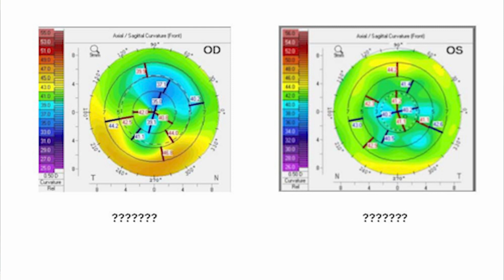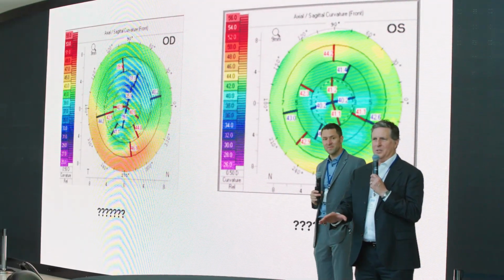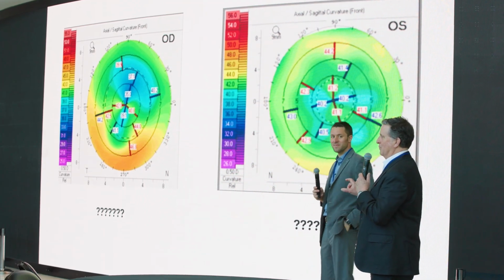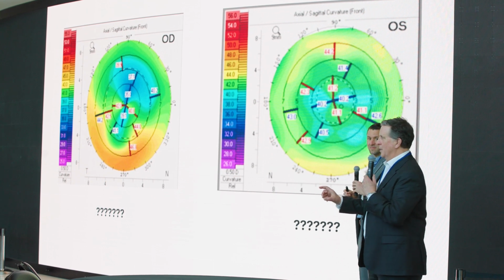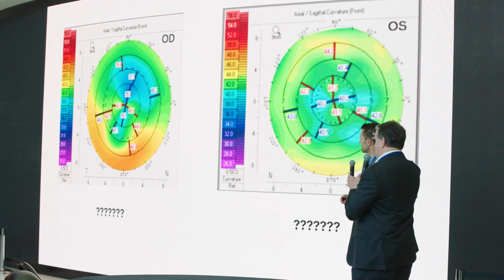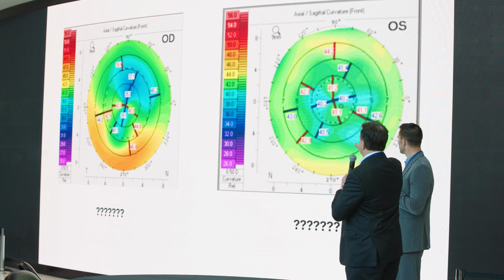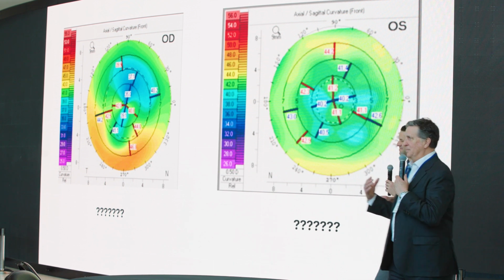Do you? If in doubt, my rule of thumb for topography is if it catches your attention and you look at it for more than 5 seconds, there's something abnormal or atypical, and they're probably not a good candidate for incisional techniques. They might be a good candidate for a toric lens, but I would not. So that kind of looks like contact lens induced irregularity, or could be post-RK. This one, a tight little bow tie centrally. You've got to be really careful with those. So I would not treat that as well. So again, this is where experience comes into play.